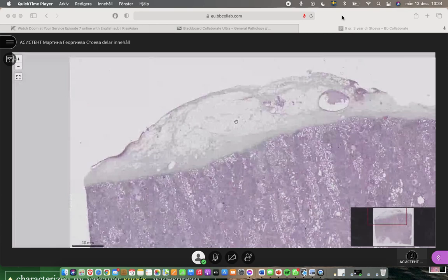And now the pathologic process. I think that at low, medium magnification, but not the low one, in between the normal glomeruli, or a little bit hypertrophic ones, we can find some others that look like small pinkish balls. Note that they are smaller than the normal ones and they are completely hyalinized.